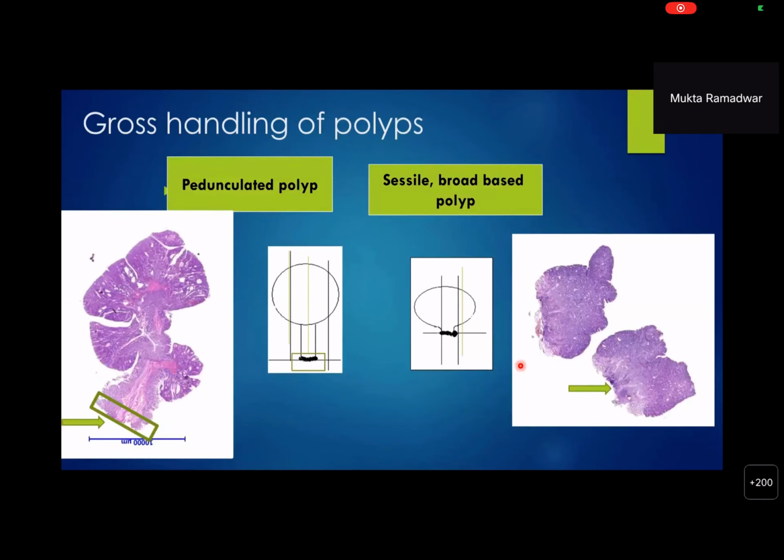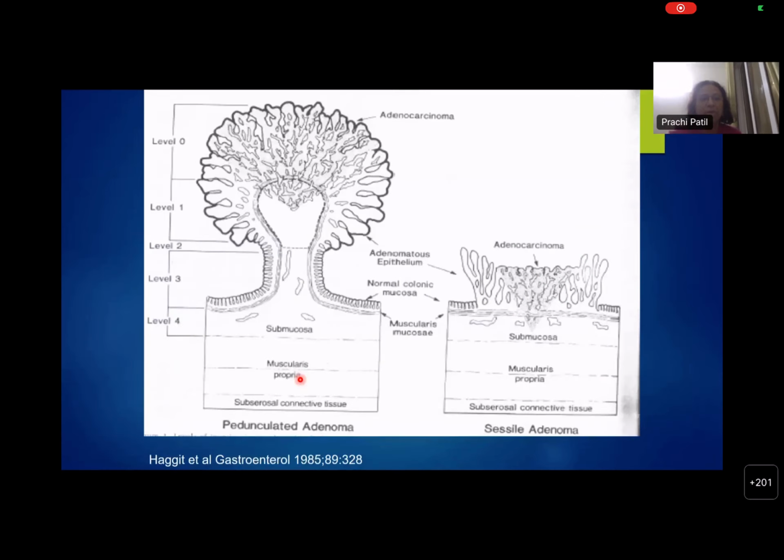Madam, just one comment. Yeah. So just to explain the endoscopic terminology. What you mentioned right now was an endoscopic mucosal resection, EMR. Typically when we say an EMR or a polypectomy, we inject a colloid with a contrast like methylene blue dye into the submucosa to lift the polyp. So the plane of resection in an endoscopic mucosal resection should ideally be the upper part of the submucosa. You may not actually get a submucosa when the specimen reaches you, but that's supposed to be the plane. So you're supposed to have a very thin layer of submucosa in the resected specimen.